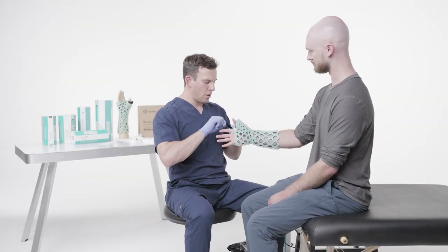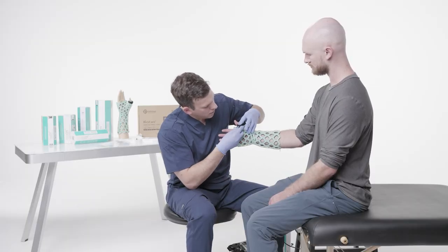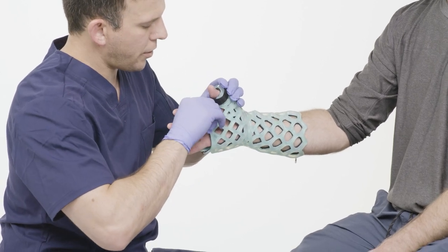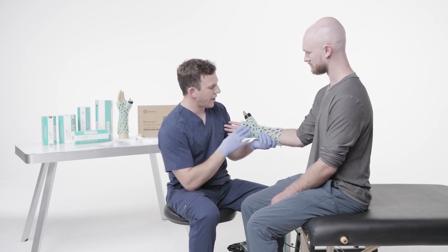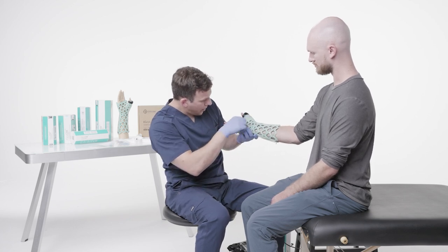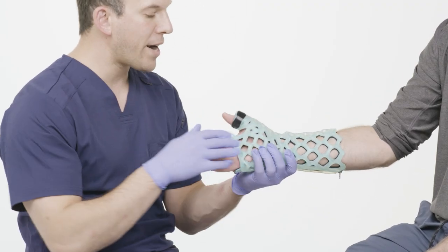I'm going to put the Velcro strap around the thumb, making sure it is nice and secure and snug so when I start to cure, the thumb is completely immobilized. The button came undone — you can easily just put it right back in. Now I'm going to do another inspection with the brace on. I want to make sure that none of the silicone is touching the skin and it's protected by the rubber foam. I don't see any leaks or cracks, and the zipper is still intact — so now we're ready to cure.